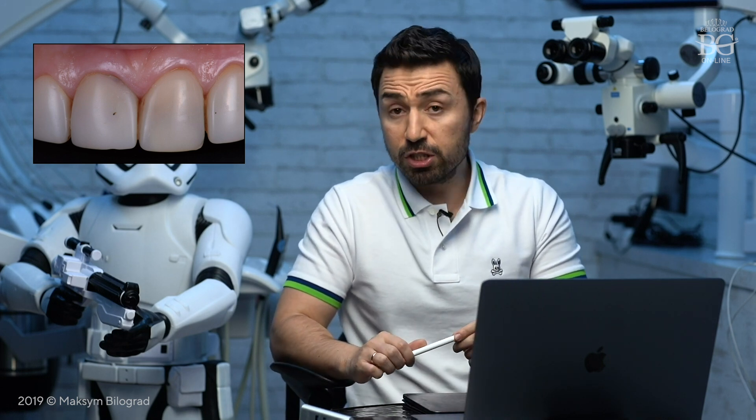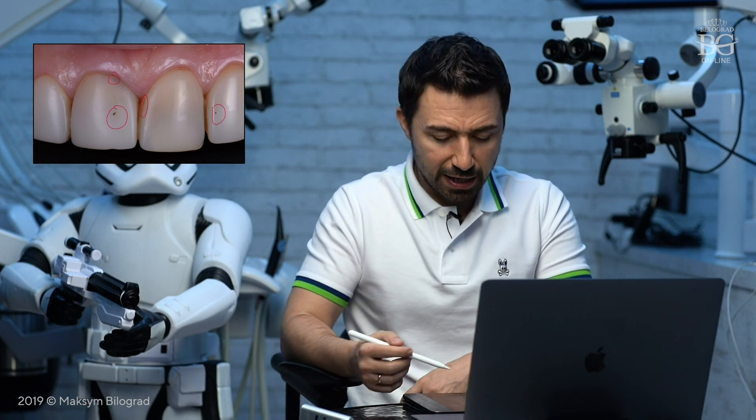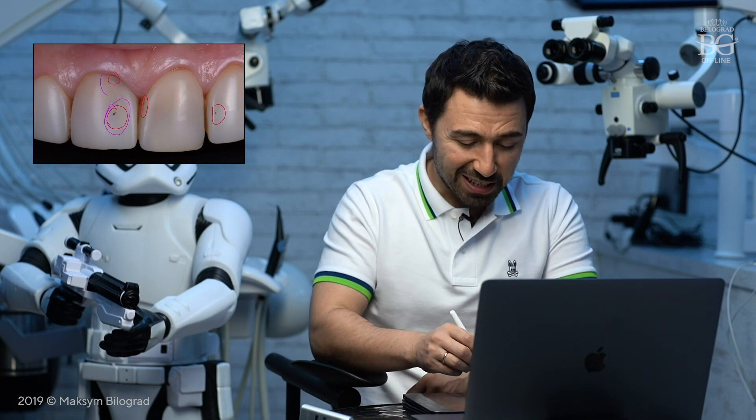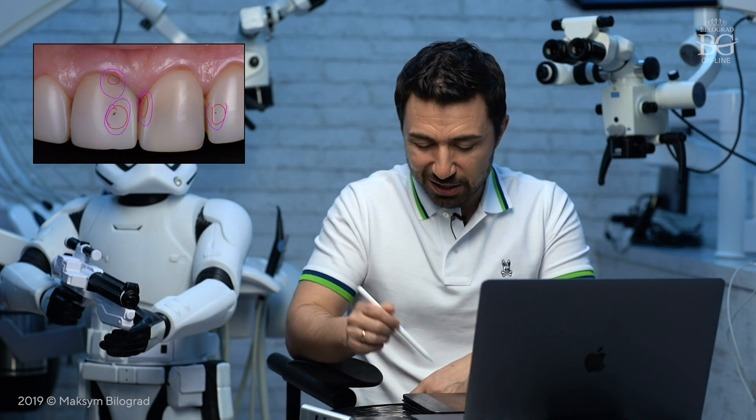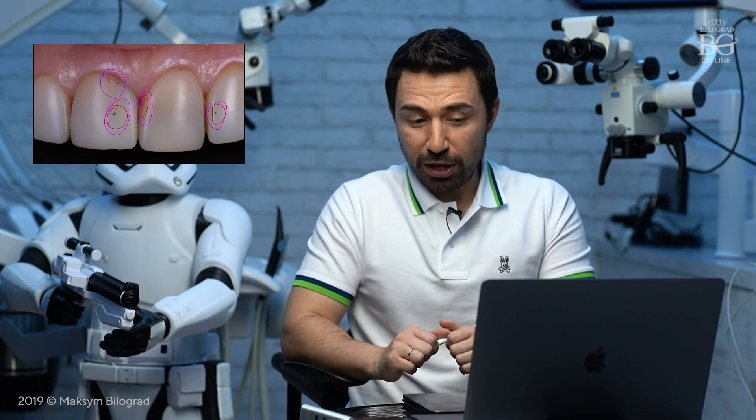In this case, the patient came to our office with old composite restorations and was not happy with their appearance. You can see some fancy design with black spots — maybe artistic elements of composite restorations. Anyway, she wanted to change the color and shape of her teeth.